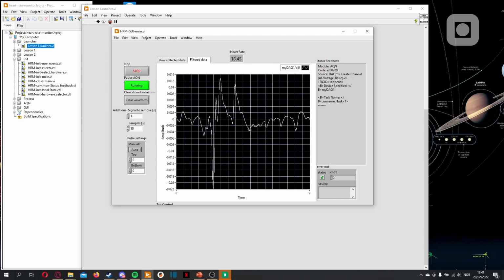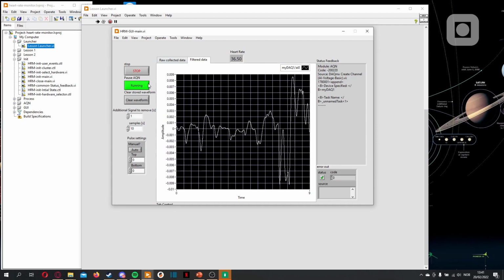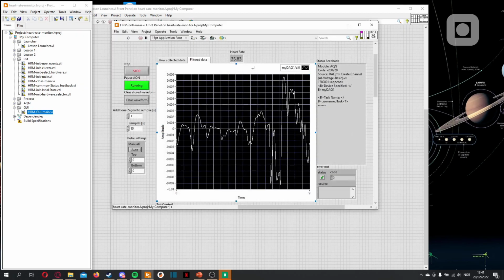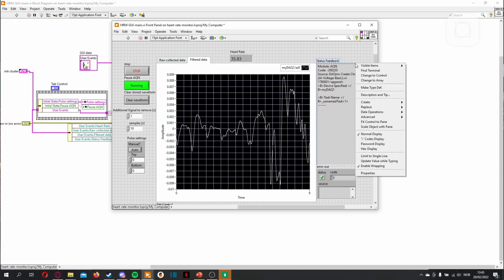And we can see also that this one takes a little bit too much space at some point. So let's make this one bigger. Let's stop it. Let's make this one a little bit bigger. And this one should really be cleared on startup. So the thing is, if we got more feedback here, this would be cleared, but it's the remnant of the last one where this control indicator hasn't really been handled in any way. So it remains. But let's avoid that.